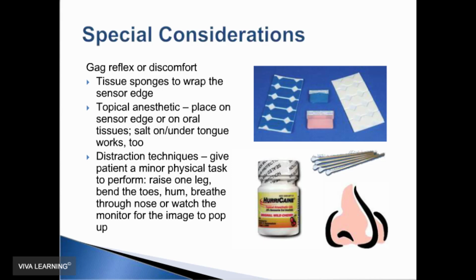If that doesn't work, then you can also give them a minor physical task to do while you're placing the receptor in the troublesome area. The classic distraction technique instructs the patient to raise one leg and hold it in the air while you're placing the receptor in the mouth. I find that this is very difficult for patients to maintain, but it does work.